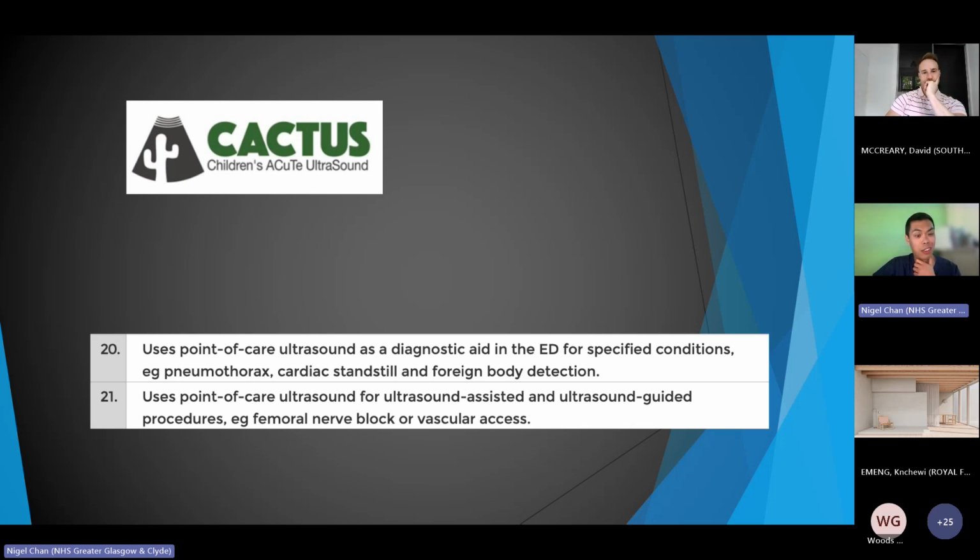At the moment, I think I still need a lung module that's there. And that was a good introductory to how to use the machine and getting used to looking at scans. But to be honest, from an ED point of view, most of the children that we see from a lung point of view are just wheezy. And doing a lung ultrasound, I rarely get a chest x-ray for the kids I see anyway, so there wasn't actually a huge amount of opportunity that I was scanning people day to day.